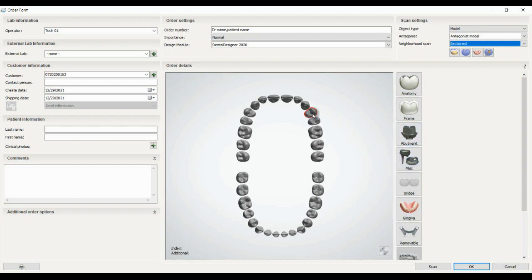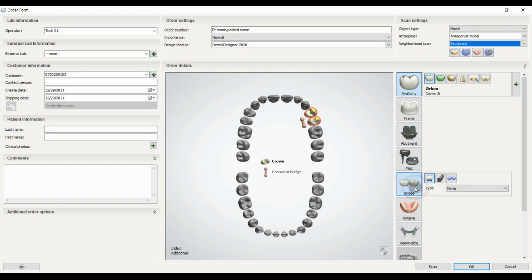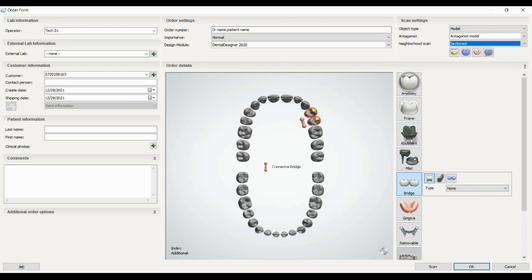Next option: if we have more than one tooth in our order that are near each other and we want to splint each other or bridge it, we can choose this one and the bridge icon will appear. We have three types of bridge: non-bar and bar. This helps us to create a bridge or a splint.